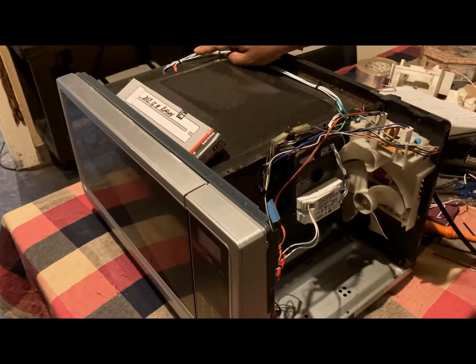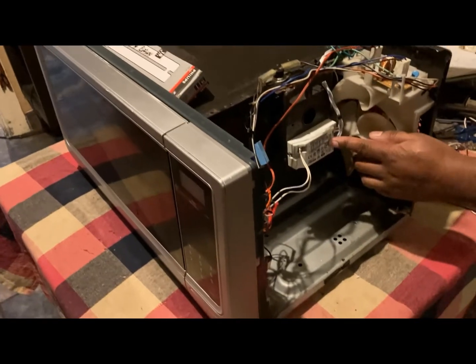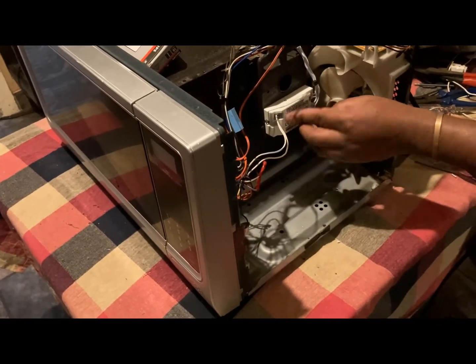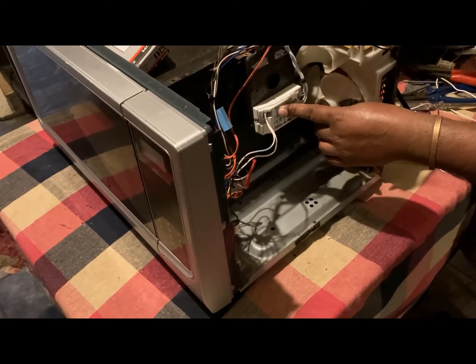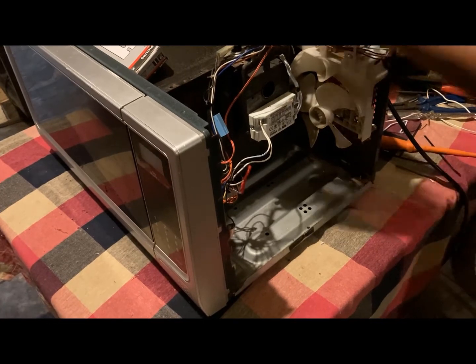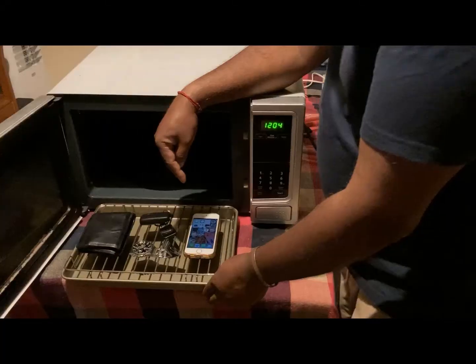I got two sets of wire connected from the lamp holder to the ballast, and my brown and black wire is connected to the ballast. So now the connection is complete. I will just close up, and then I'll put in my UVC lamp, and then we can test it.